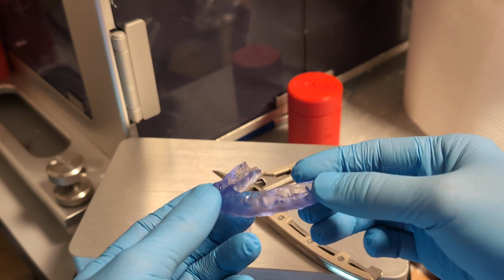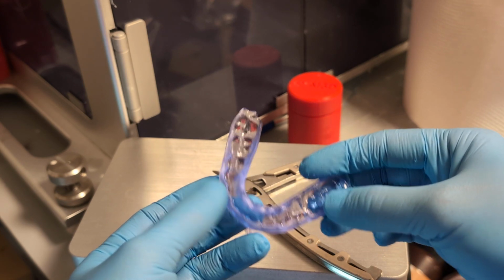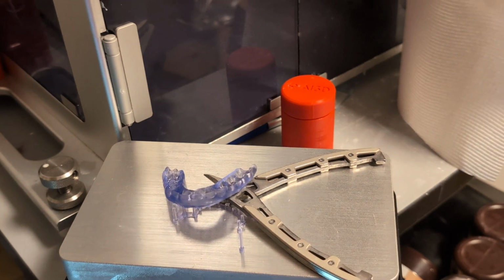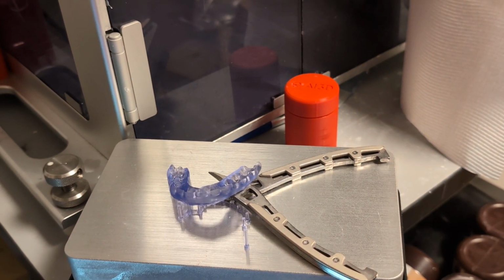So I'll wait for this to properly dry and then I'll cure it. But yeah, really liking this new support. The new supports on Rayware Cloud for splints. It's going to be an absolute game changer for same day splints. Awesome work.